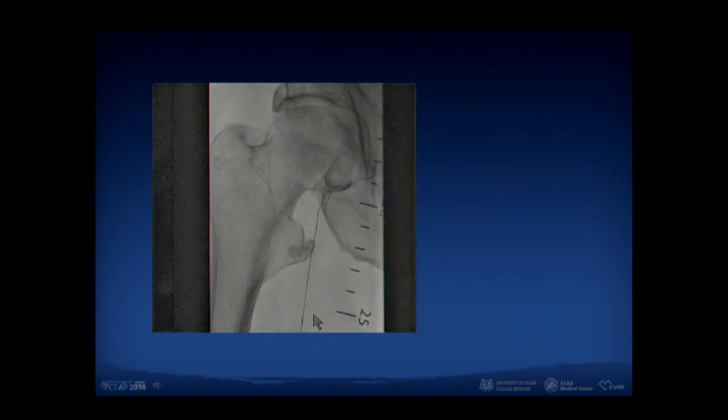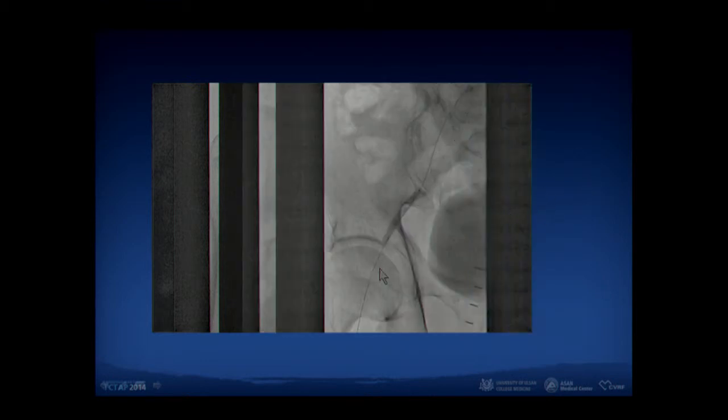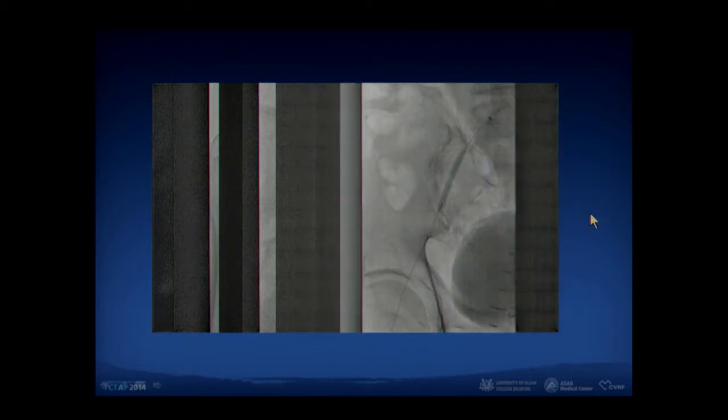This is a command wire, CXI catheter. For the common femoral portion, I tried an intraluminal approach to avoid stent implantation. A bidirectional approach was also done. Finally, the wire went down, and then balloon angioplasty was done like this.